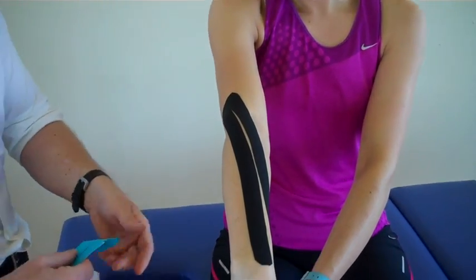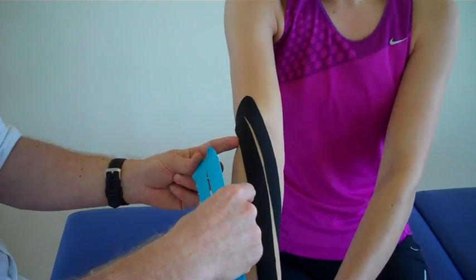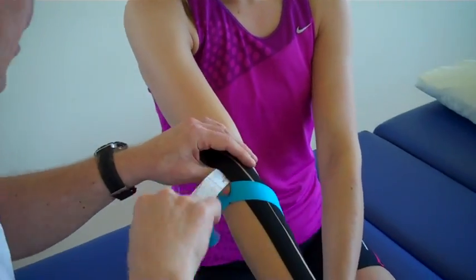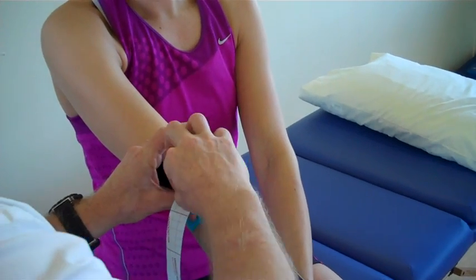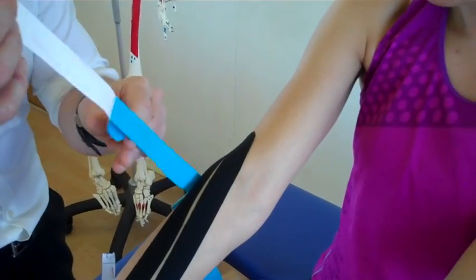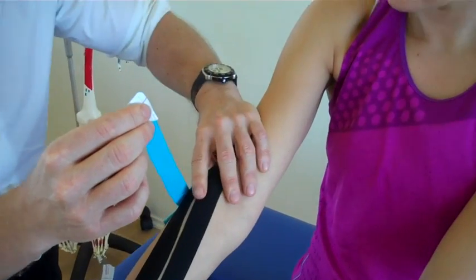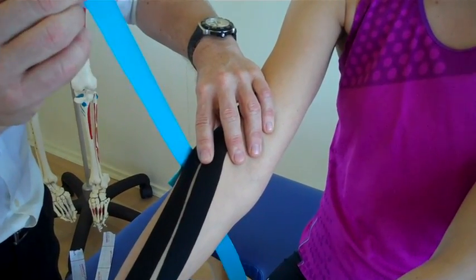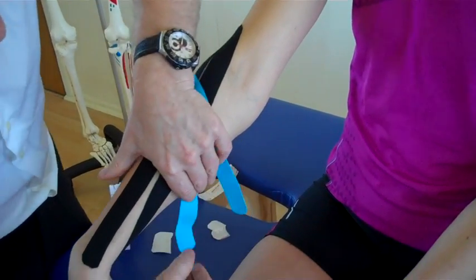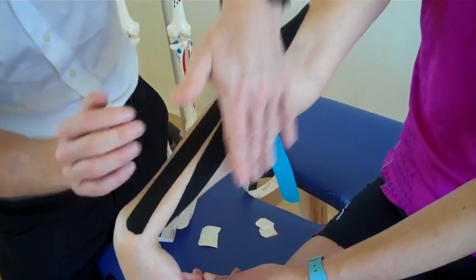Same on this second tape — I've already split it — so we apply no stretch on the beginning. We apply this just below the elbow with no stretch. Using one of the legs, peel that back. The difference this time is we're going to slacken the tissue — you can use your thumb or your finger to just slacken the tissue — and then use the tension of the tape at about 80% stretch, and we come around and feed that around like so.